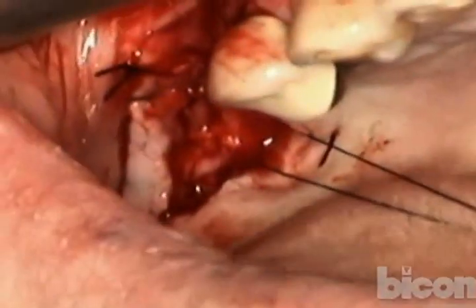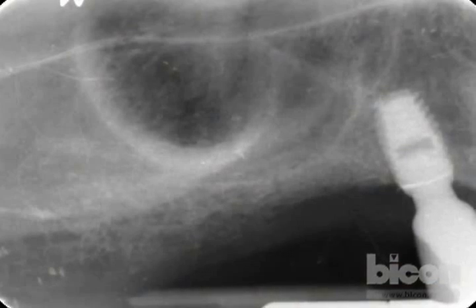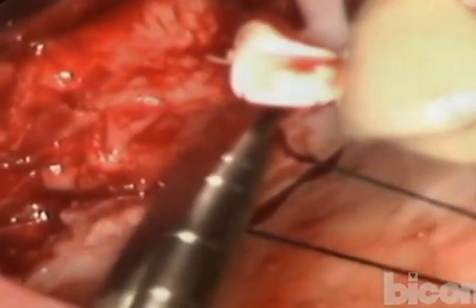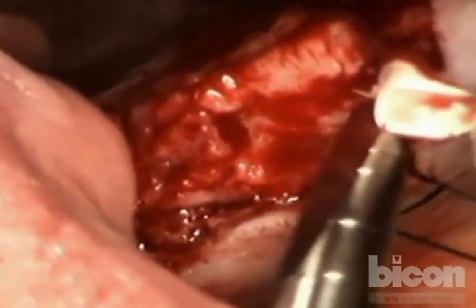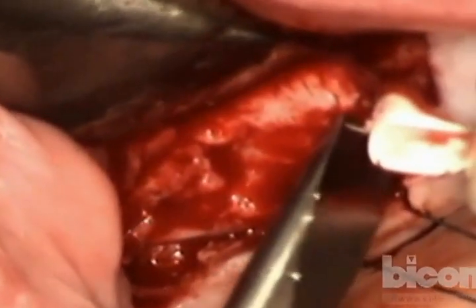Okay, now what I need to do is design our window. If you remember from the radiograph, we need to stay approximately 3 to 5 millimeters posterior or distal to the existing implant. And we can go about a centimeter in total length then. Stay up. Okay. So this is a 5 millimeter osteotome. By going from the back of the implant, I can estimate where I can make my cut, and that will be right here. And I'll go right on top of the crest.